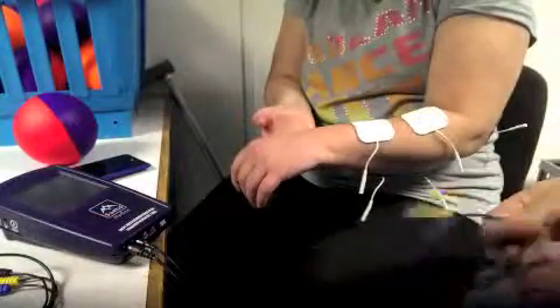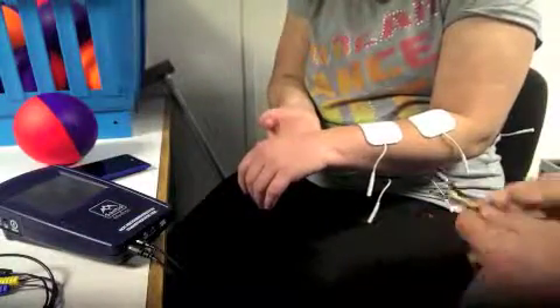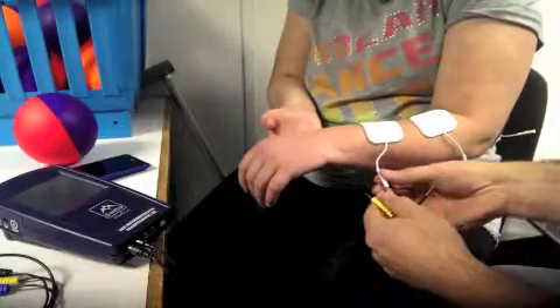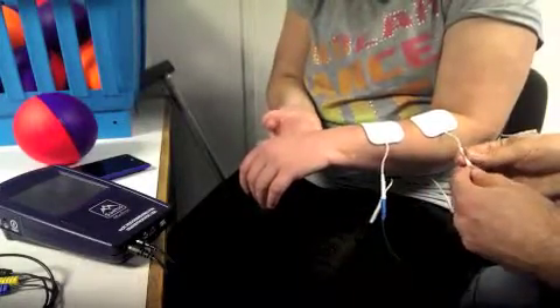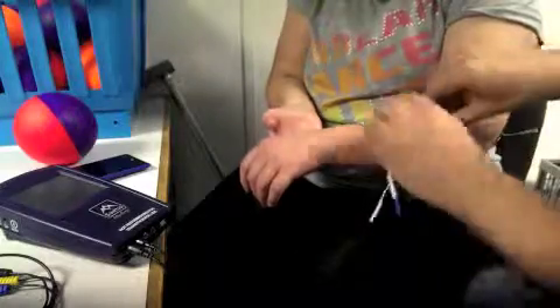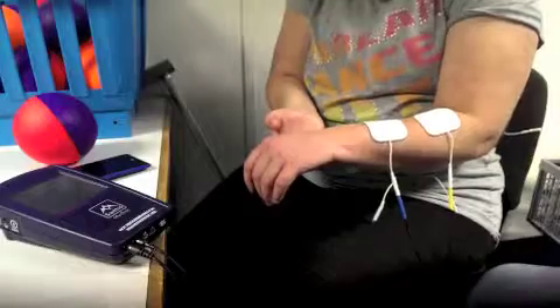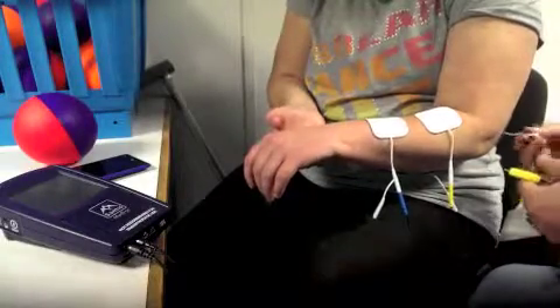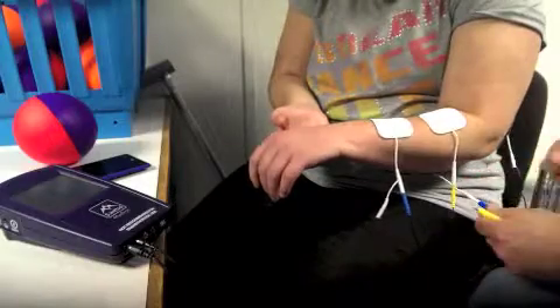Find channel A, which is the stim. It doesn't matter whether you use blue or yellow, because the current alternates. And these are for channel B underneath. Black is your earth — and again, it doesn't matter.